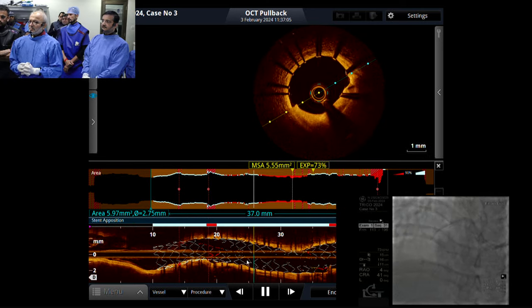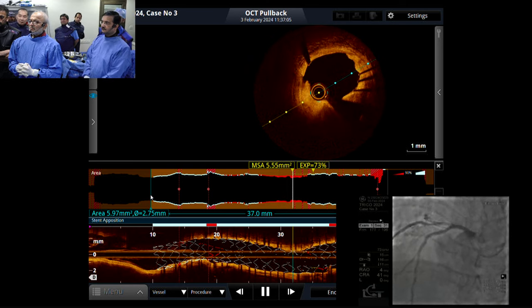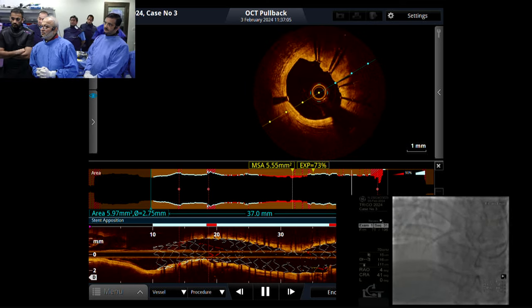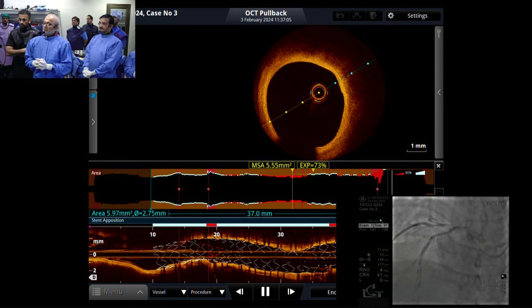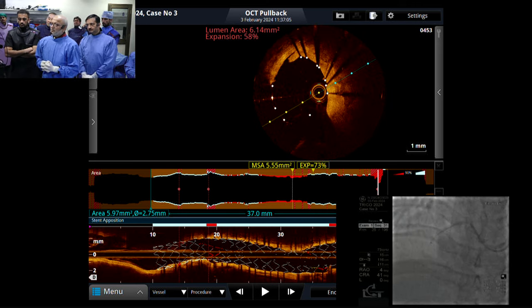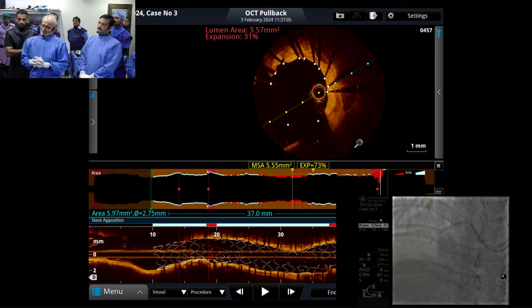When you say minimal protrusion in the left main, this is an acute angle bifurcation. When you have a minimal protrusion in the left main, if something happens to the circ tomorrow, what would be your implications? So how will I address this case? I will definitely put the stent into the left main, halfway through the left main. I would do a POT, make sure the circumflex ostium is clean for future interventions.